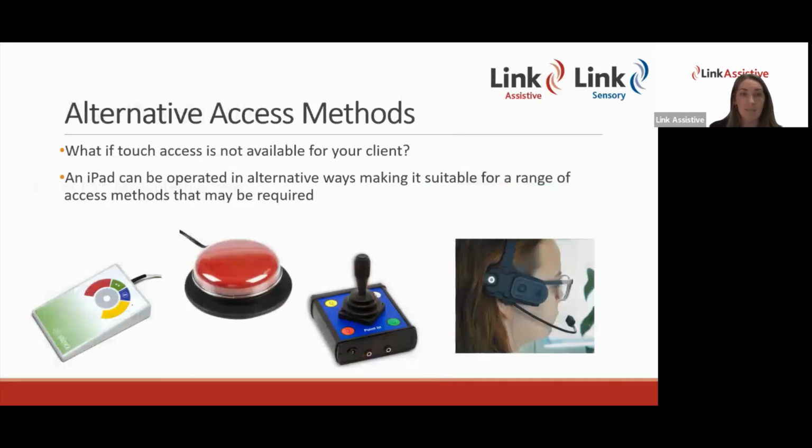So maybe the fine motor control doesn't allow them to accurately touch the screen, and adding a keyguard hasn't been able to, I guess, help that. So you could use an alternative access solution such as a switch or a joystick or a head pointer like this lady is wearing, which means that the iPad can be operated in another way. So that's a nice option as well.